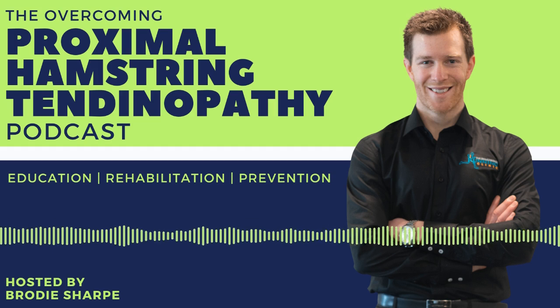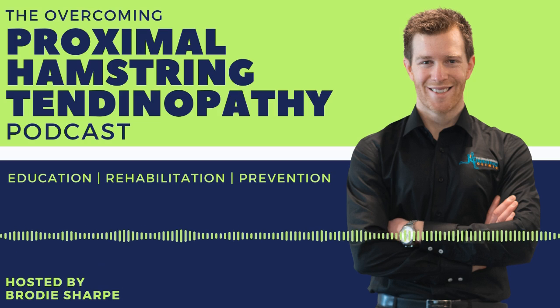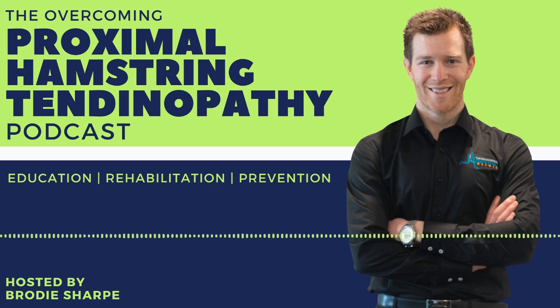The other point I wrote down was Benoy mentioned there's 3 reasons why you wouldn't respond to shockwave. 1, either the diagnosis isn't correct. 2, you're not in the right stage of that rehab or the right stage of that tendinopathy. And 3, it's not associated with any loading. People just think that shockwave is going to heal the tendon. They do shockwave and they think it's going to get better. It just doesn't, because they haven't compiled in or mixed in some sort of loading program. So that was those 3 points.